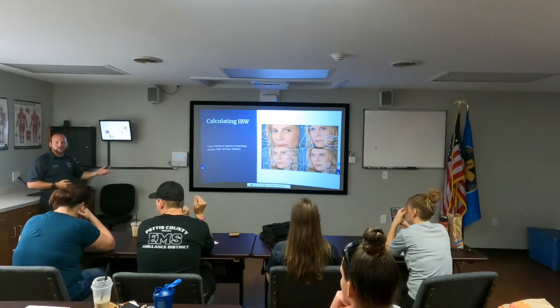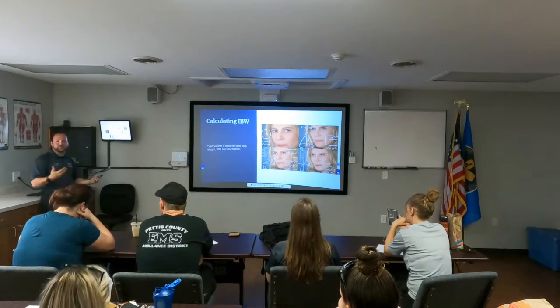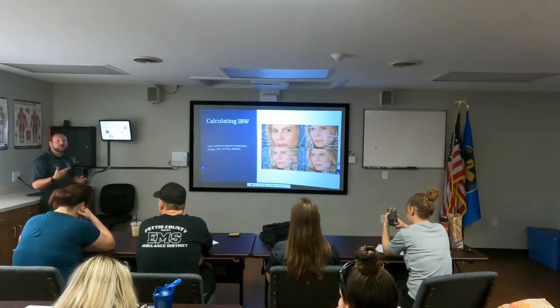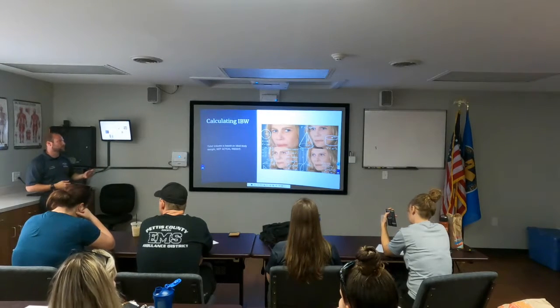The only issue is that someone who's 5'4" and 600 pounds is going to have that extra pressure of that extra body weight on them. They may need a little bit higher tidal volume to overcompensate for that, or we might have to have an increased respiratory rate.